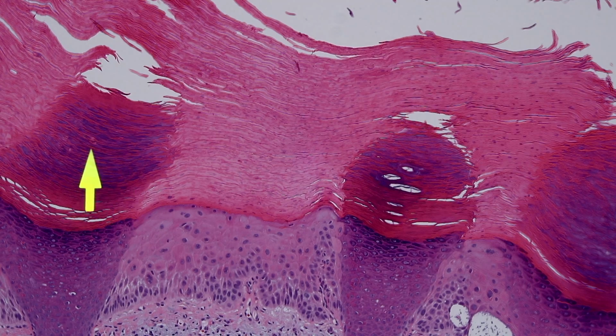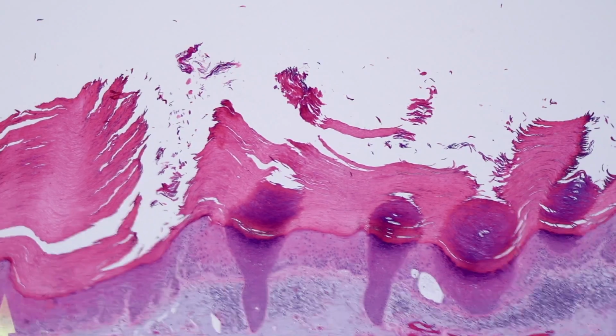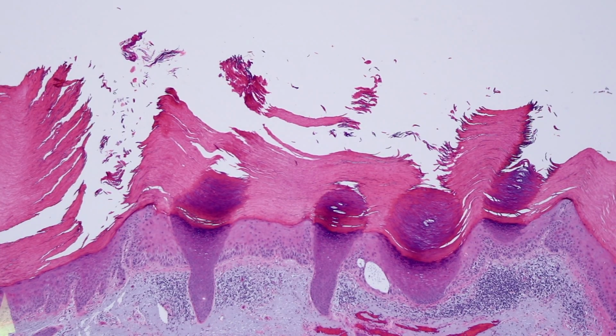And so I've had trainees ask me, well, why does it turn kind of blue like this? I honestly don't know the answer. I think it's because the skin on the dorsal hand is kind of close to the acral skin, like the palm, and in the palm and sole, you tend to get a little bit of this bluish look to the stratum corneum, and I feel like the skin on the back of the hand has some of those similar properties. So I don't know enough. There are people who are experts in the cornification process, and it's really complicated actually, and way beyond my knowledge at this point.